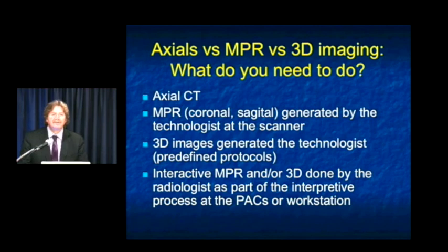It's been my experience when the images are already created, radiologists will more commonly look at them. If they have to do it themselves, they're not going to look at it. We also like 3D imaging. Some people like 3D generated by the technologist or by a 3D lab. I like to do it personally. But however you do it, it's very important to recognize that that provides critical information in many cases that the surgeon, oncologist will need to manage the patient.